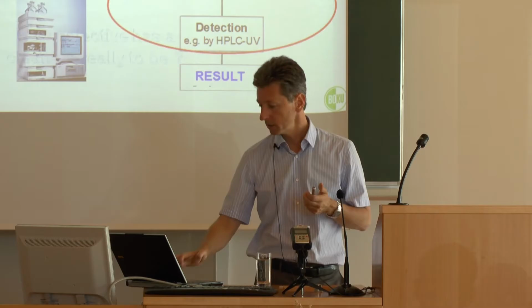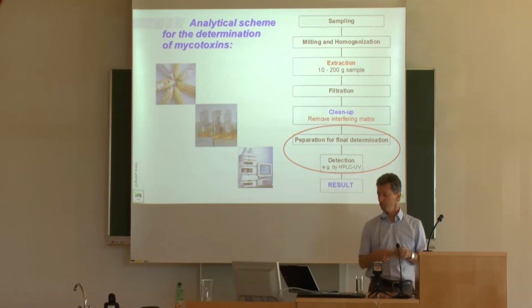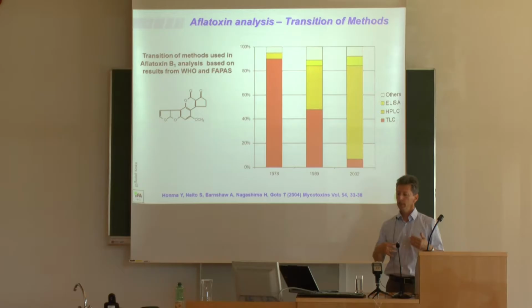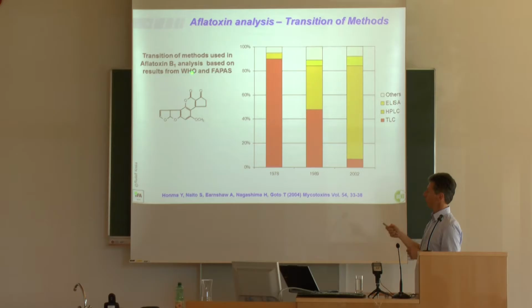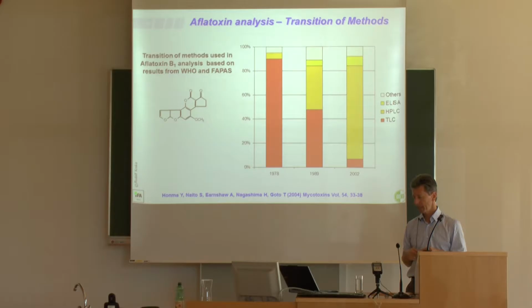to be. And that actually brings me to the next step, to the separation and detection by, for instance, HPLC-UV or LC-MS/MS within this analytical scheme for determination of mycotoxins. And we see here quite a rapid, or impressive, transition when checking the methods which are around for aflatoxin B1, based on the results of WHO and FAPAS. WHO, well, the World Health Organization, obviously, FAPAS, the proficiency testing scheme offered by FERA in York.